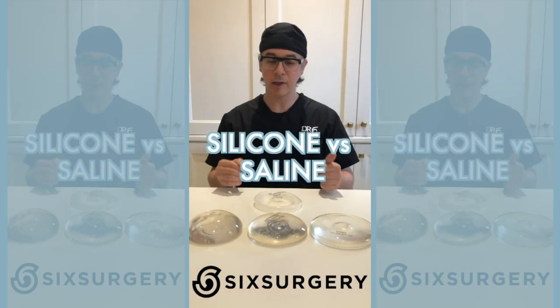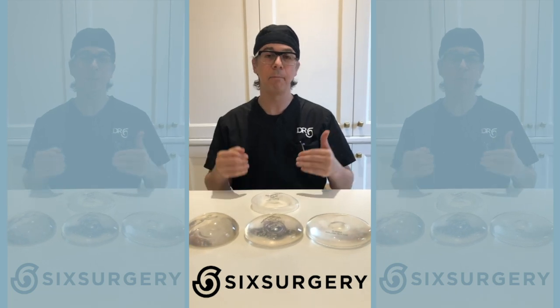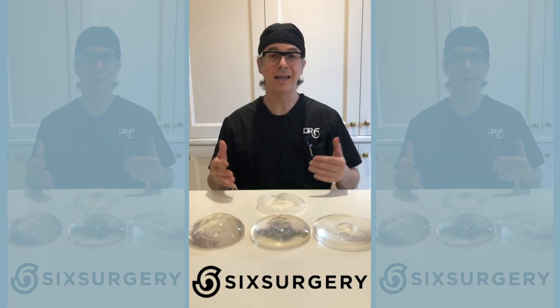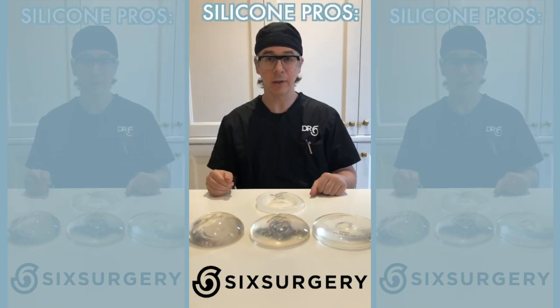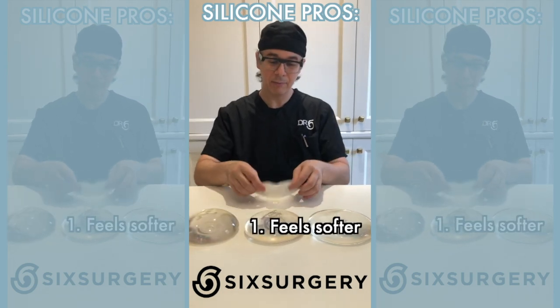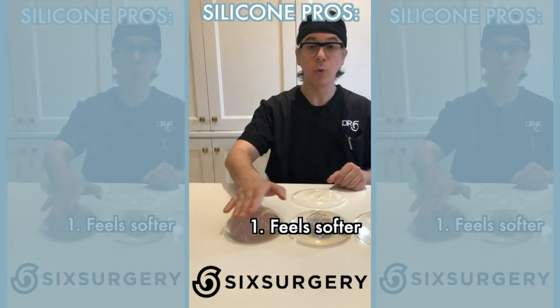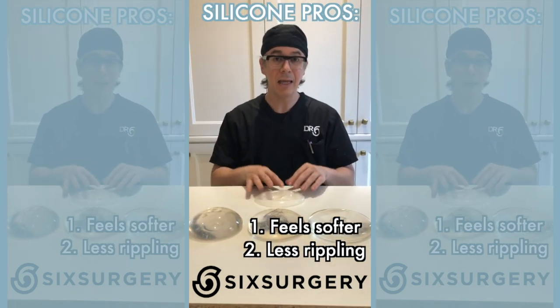When deciding between silicone and saline implants, if you go online most people will talk about silicone as the better implant. But it's not the best implant for everybody. In my practice, about 50% of patients get saline. The reasons to choose silicone are twofold: they feel softer — saline really feels like a water balloon — and silicone appears smoother with less rippling. In general, silicone implants ripple less than saline, but they still ripple.